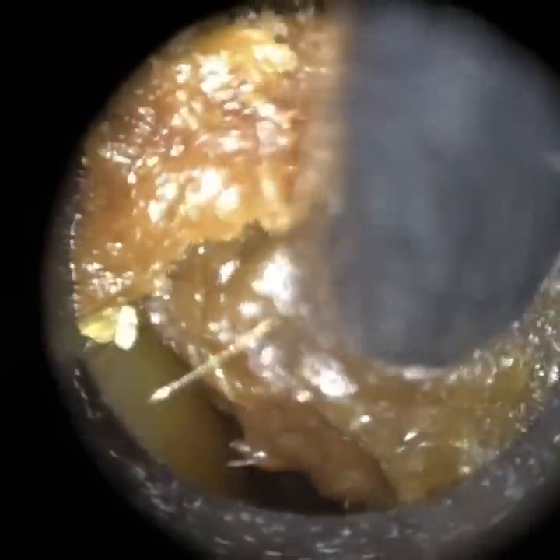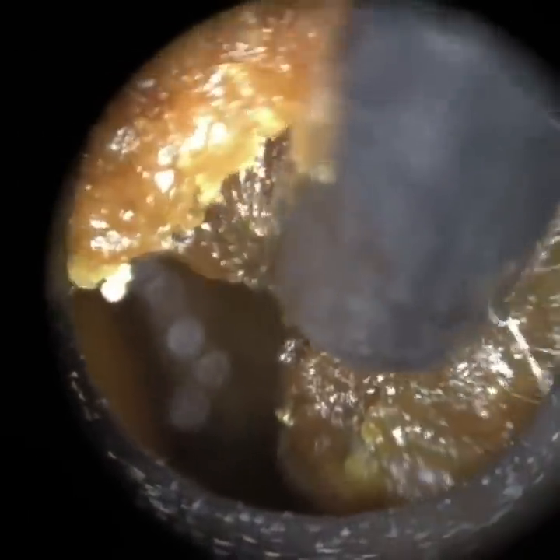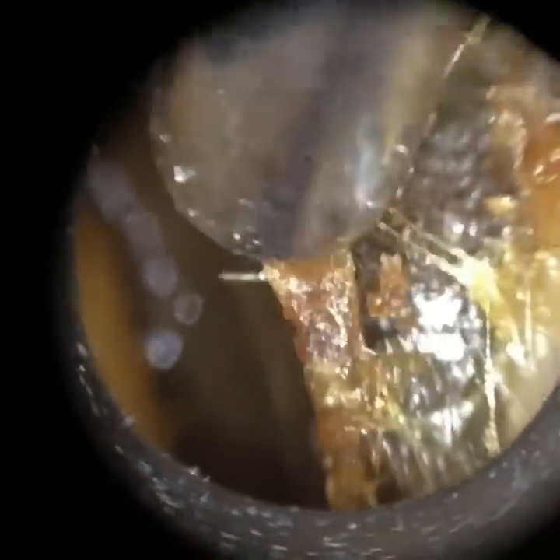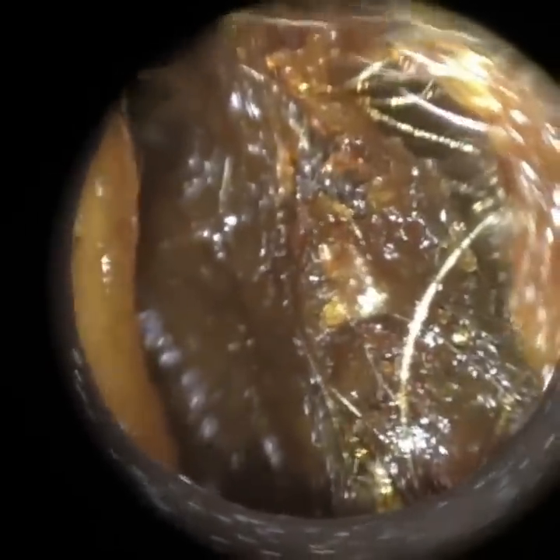This is their left side — it's a bit narrower actually, so we're having to dilate the ear a lot more. You'll see the midsection of the ear canal was definitely much more narrow than the right side. Very sticky consistency of wax, and the key here is to try and elevate and separate the wax from the canal wall. Where all those hairs are on the right, that's the first bend, so I'm just dilating the first bend. The most common site for wax impaction, unless it's been pushed in by the patient, is between the first and second bend — known as an isthmus.